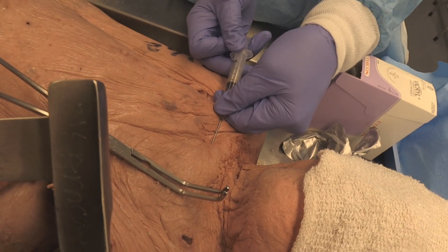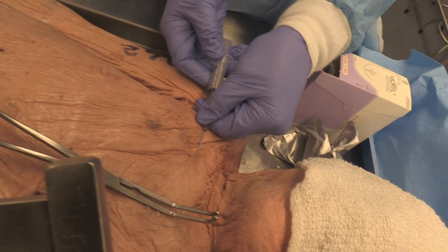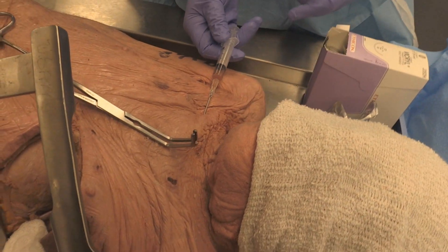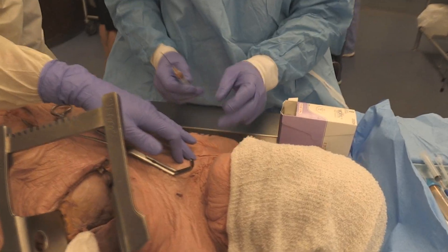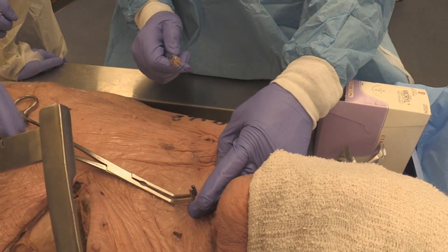Bevel turned down — see how I'm getting the fluid back? You're in. That way you're right under the clavicle and you won't get into the pleura. I go at like the distal third, almost half a distal third like that.